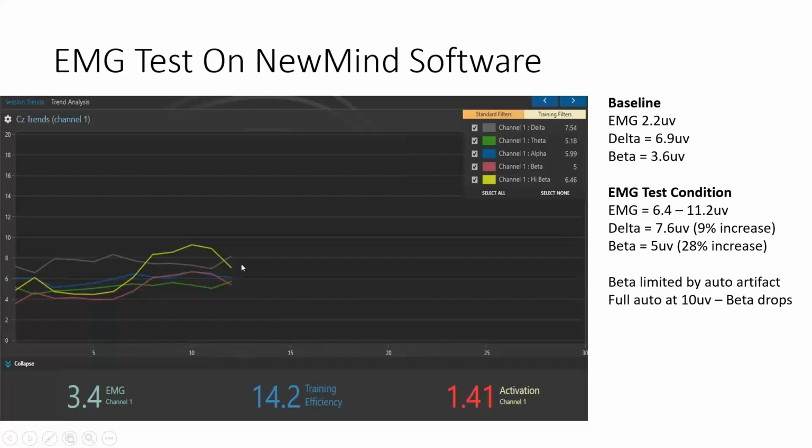Brain's probably shrinking at 70 years of age. But given that's the case, when I tensed up my muscles really hard, look what happened. This didn't go up high. You know why? Because when I tensed my muscles really hard, it kicked off the high EMG filters, and they just cut out the EEG.